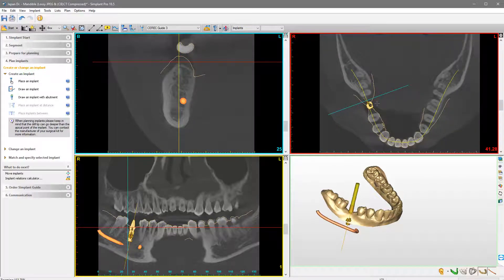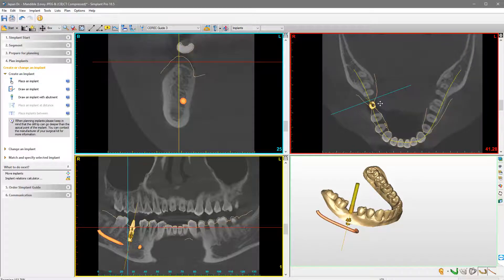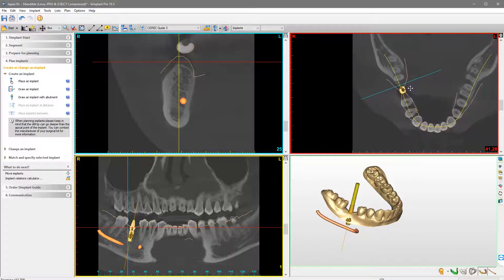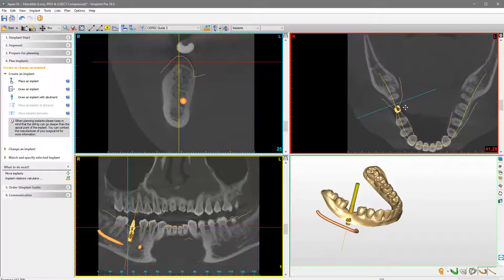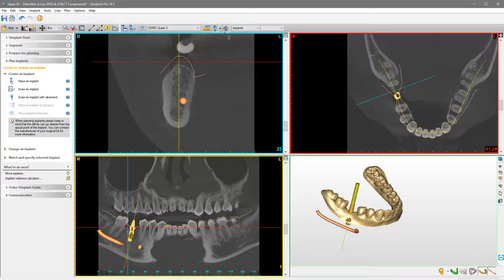To center the view, please hold your SHIFT key and the right mouse button of your mouse while moving it up and down. For demonstration purposes, we zoom in and afterwards center the 3D view by following the instructions given before.